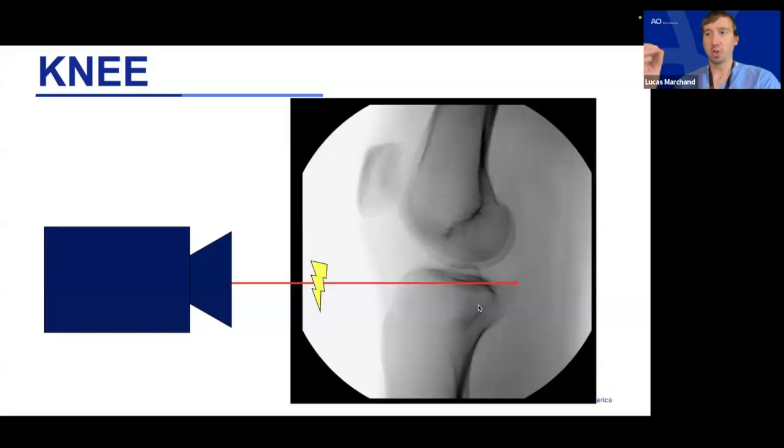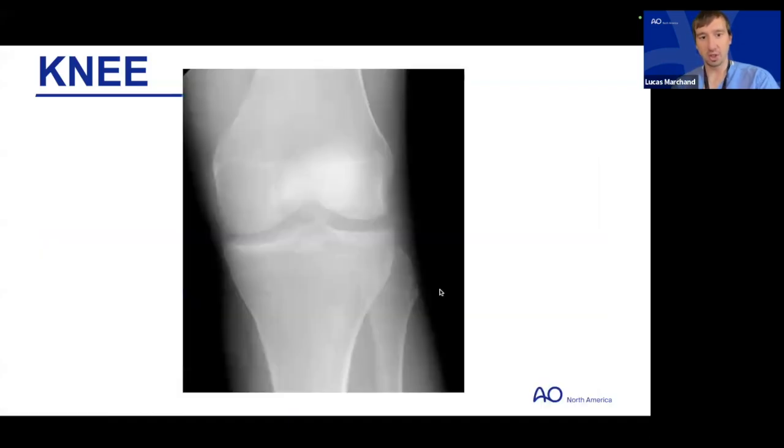And then one of those specialty views we had mentioned earlier was that of a plateau view. And I want to show you quickly the difference between a regular AP, where the beam is just shot essentially orthogonal to the limb, versus a plateau view.